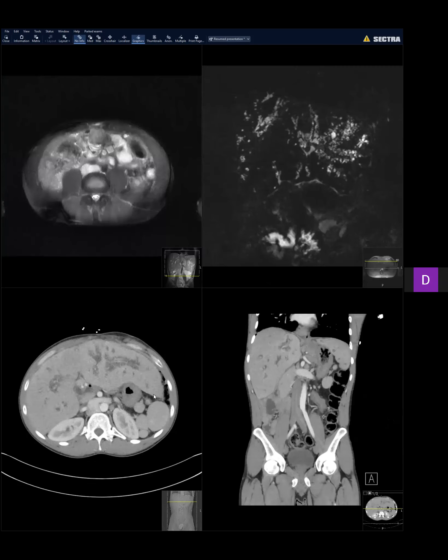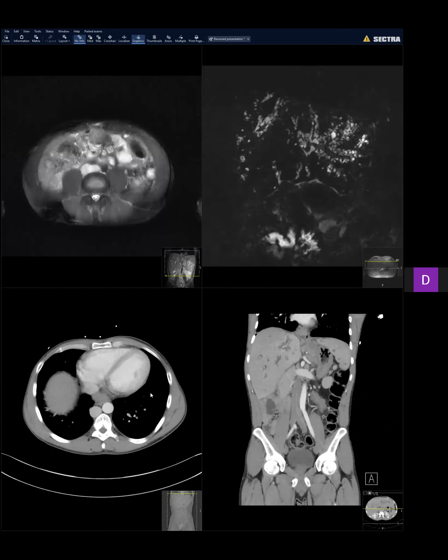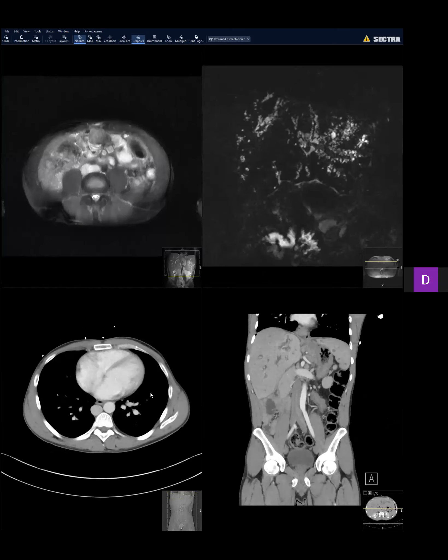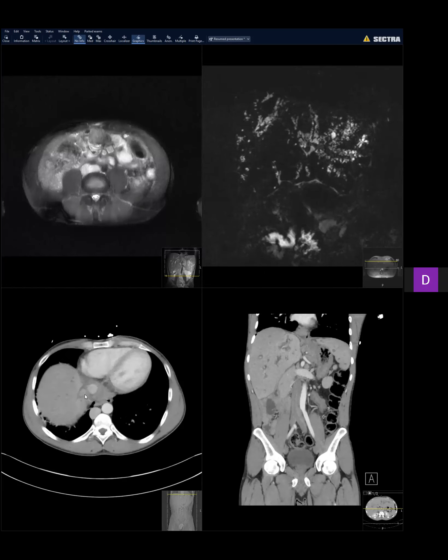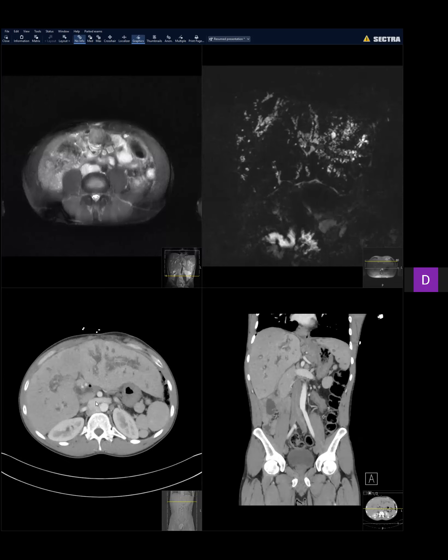This patient had biliary atresia and possibly had the Kasai procedure — portoenterostomy — at 10 days of age, but they were not sure because it was so many years back and the patient had no records. We presumed that if it was biliary atresia, the surgery they had was the Kasai procedure. We couldn't find the common bile duct.